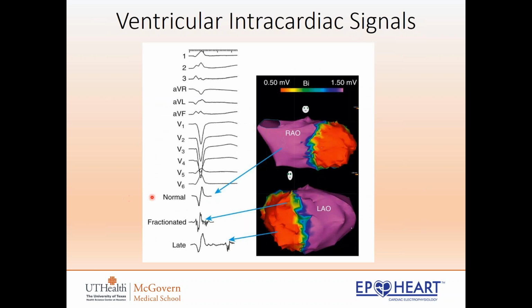And then this gives you an idea. So this patient had a heart attack. His apex is pretty much dead. So red in this case is considered dead tissue. When we see our signals inside, we see a very strong, healthy signal in purple. And then this area is what we call border zone. So this is healthy, this is dead. It's kind of the tissue in between.